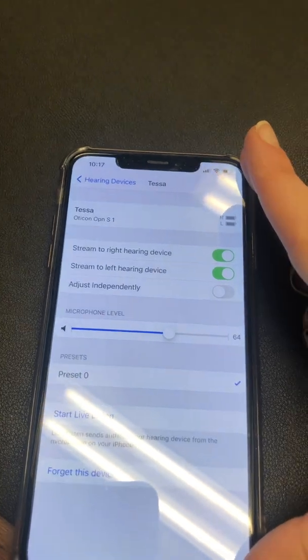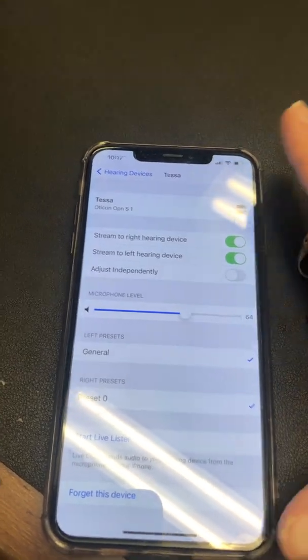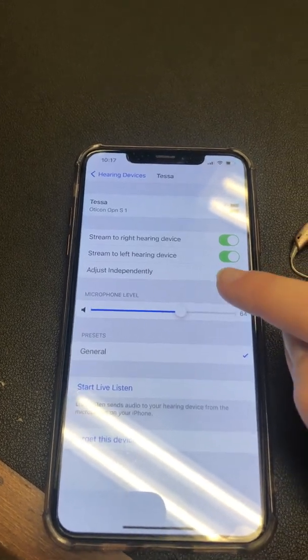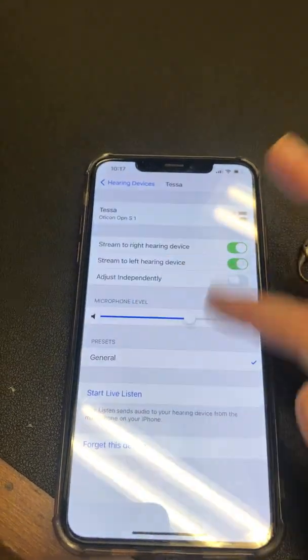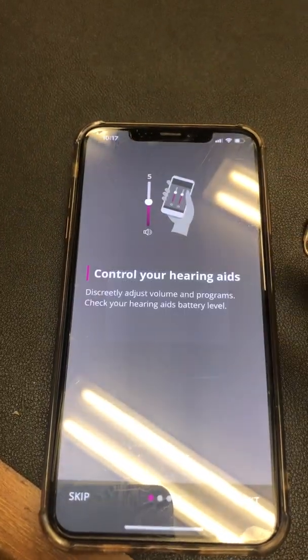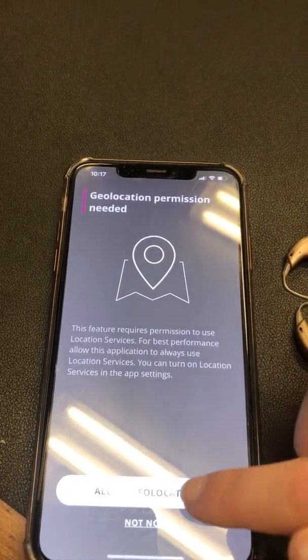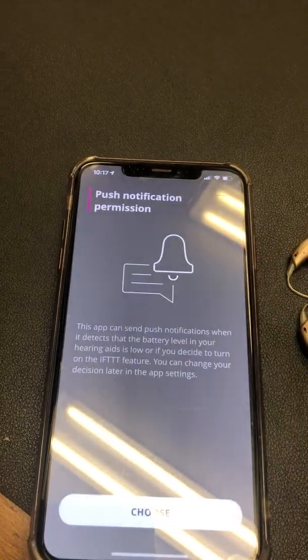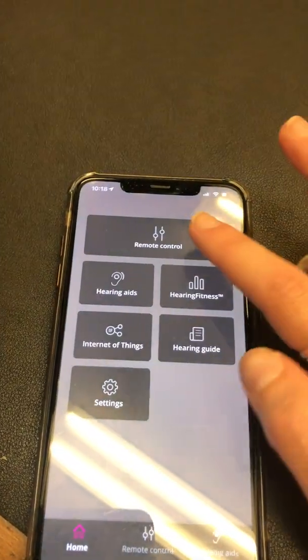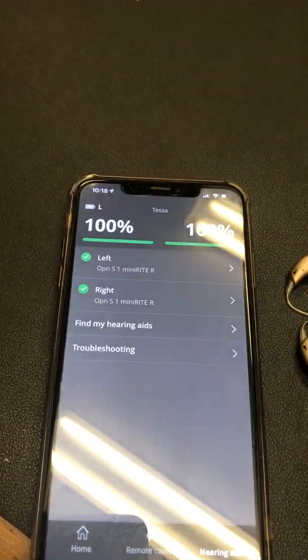This app on the iPhone is a little bit different because it works directly through the phone's settings. You can turn the volume up and down as well as adjust the hearing aids independently. Then if you go to the Oticon On app, you can activate it, find the hearing aids, and allow geolocation when using the app. They will show as successfully paired and you'll have the same controls and find-my-hearing-aids feature as on Android.